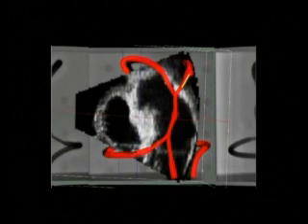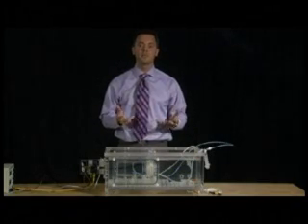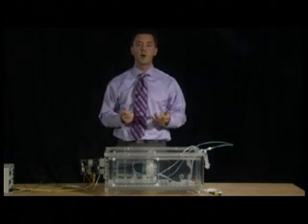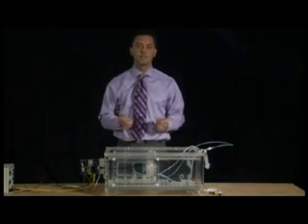Finally, because the dynamic heart phantom has multimodality contrast properties, we can use it to evaluate new ways of combining X-ray fluoroscopy with different imaging modalities, such as ultrasound as seen here. The development of these new technologies like 3D vessel modeling and multimodality imaging require a significant amount of testing and retesting in the lab, which is made much easier by using a realistic dynamic heart phantom.